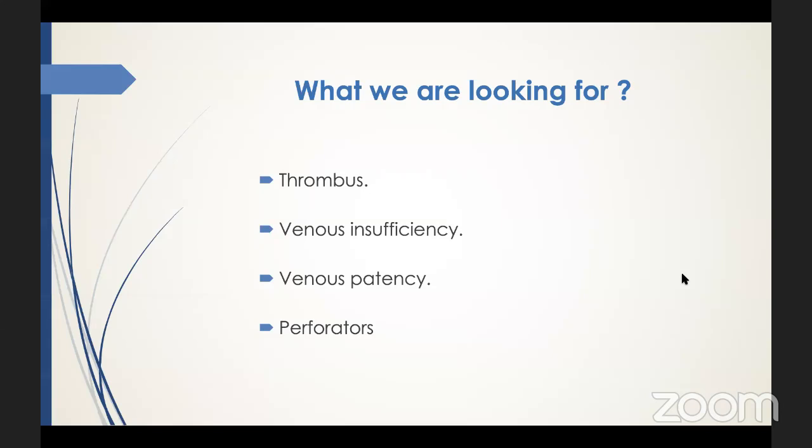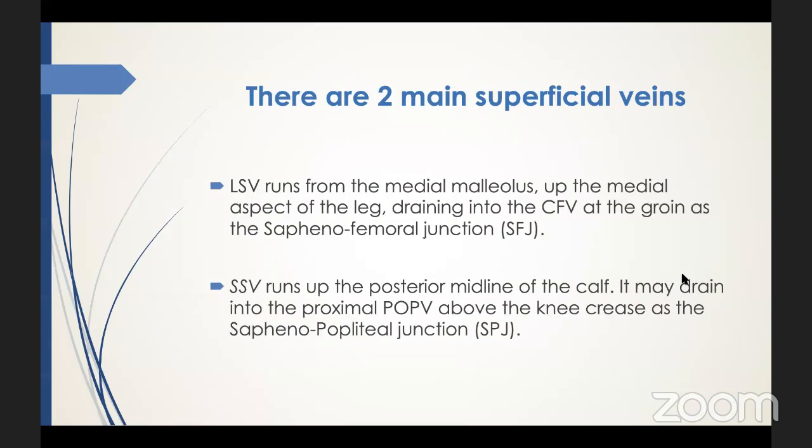And also the perforators. Measure the perforator and see the flow direction within the perforator. Are they taking the flow from the superficial system to the deep system, or taking it from the deep system to the superficial system? Quite important points we have to mention and scan.